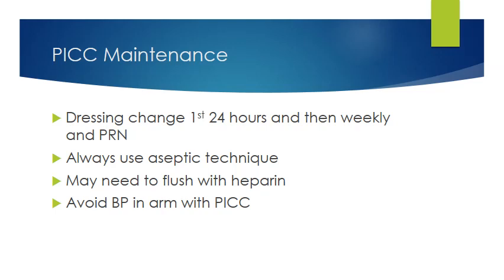So with PICC maintenance, we want to do a dressing change after the first 24 hours, and then we would do it weekly and PRN if we needed to do so. We always use aseptic technique. Insertion and dressing changes for central lines, this includes PICC, and all central lines are a sterile procedure.